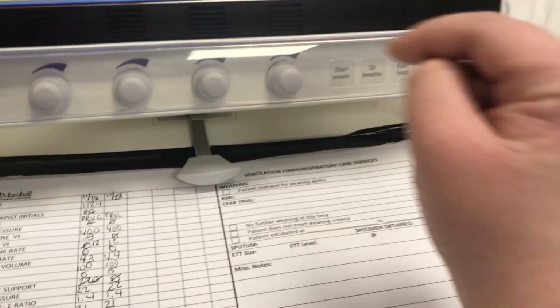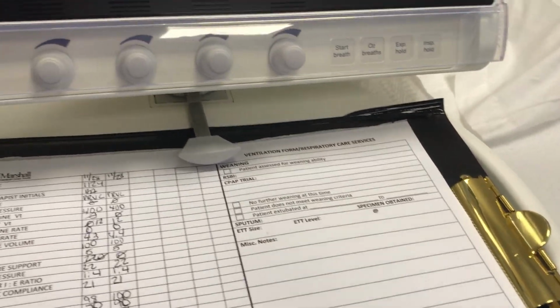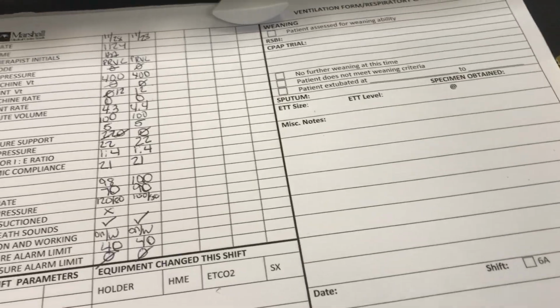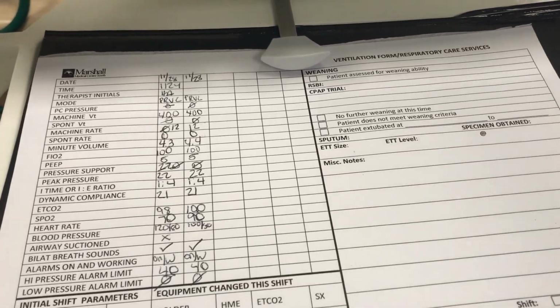Now I'd look at the monitor, get the patient SpO2, heart rate, blood pressure, and look at the end-tidal CO2 machine and get that number. Write those down next. Check if I suctioned the airway. If I did, then I would check it. If not, I'd exit the box.